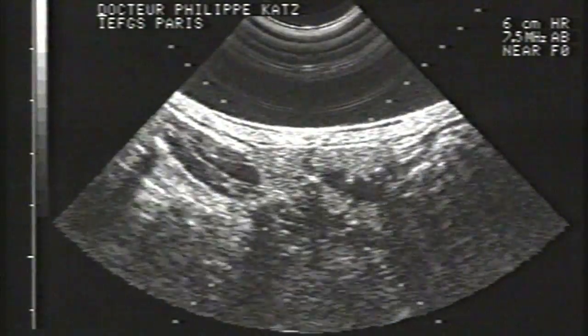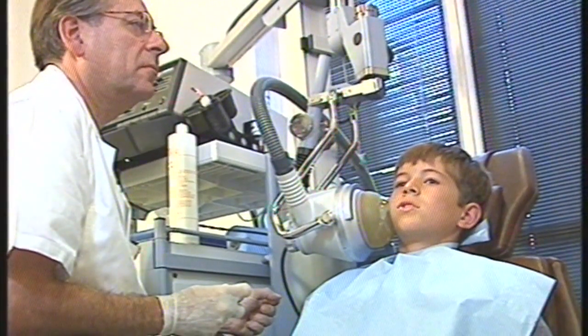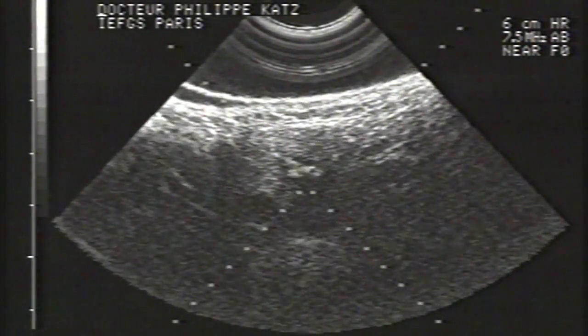The shooting frequency is around 120 impacts per minute, but if necessary may be reduced to 90 or 60 impacts per minute. During one session, about 2,000 impacts plus or minus 500 are delivered.